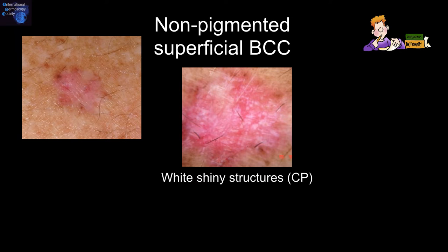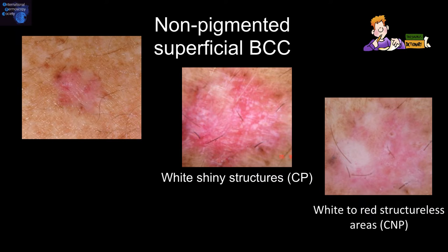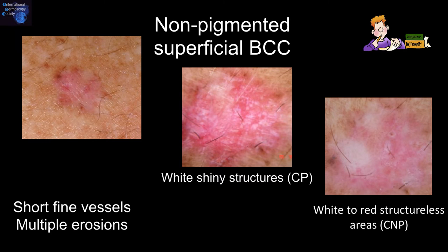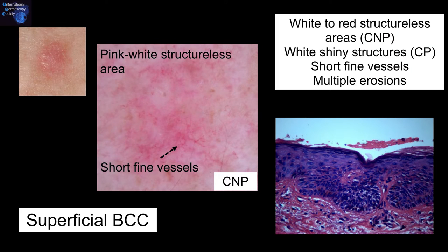Non-pigmented superficial basal cell carcinomas. The features we look for in the polarized mode are white shiny structures, and in the non-polarized mode, white to red structureless areas. In addition, we also look for short fine vessels and multiple erosions. Here is an example of a superficial basal cell carcinoma showing the pink-white structureless area and the short fine vessels.